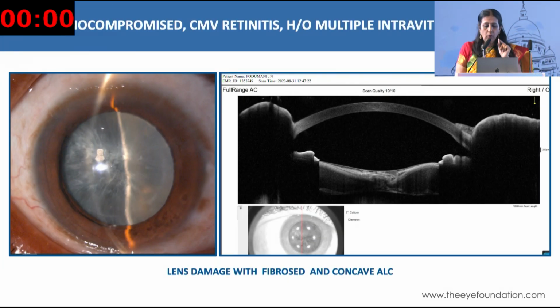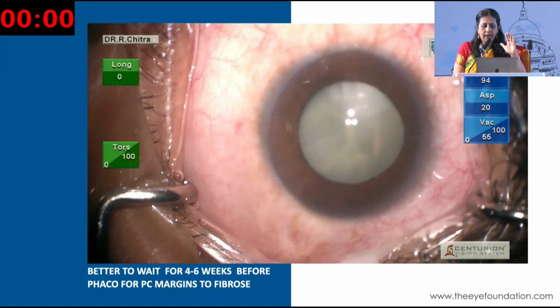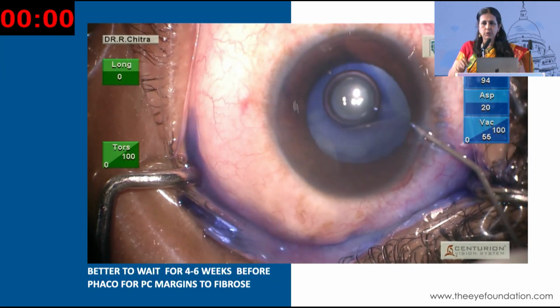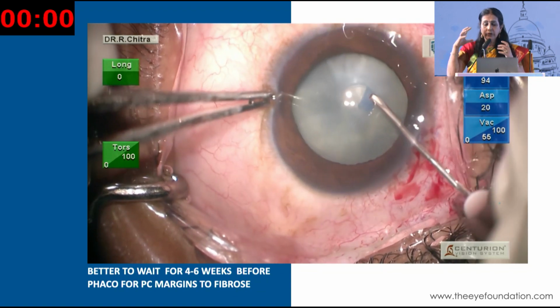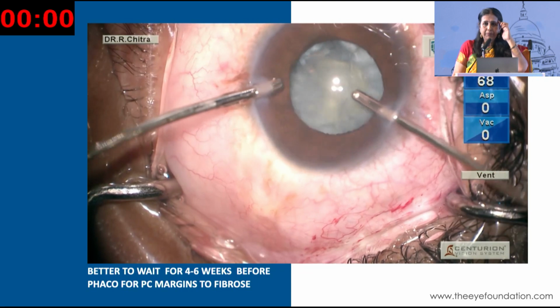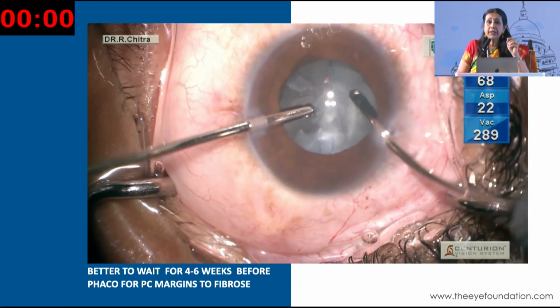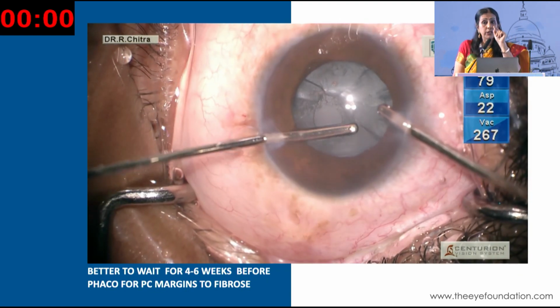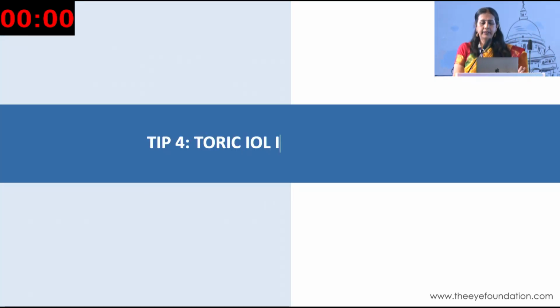And then what you should do is, if you feel there's lens touch, wait for a period of 6 weeks, let that area of opening fibrose, and then you could go ahead and do the surgery. And the last bit, when you do surgery after 4 to 6 weeks, expect a deep anterior chamber. Remember, there's no vitreous support, and you have to keep your parameters low. You need a structured wound. You need to keep in mind there could be a retrolenticular block. So you need to be conscious of all of it. And sometimes you could even have a PC plaque, and you need to be able to peel it and take it out. However, this case was very uneventful and it got done.